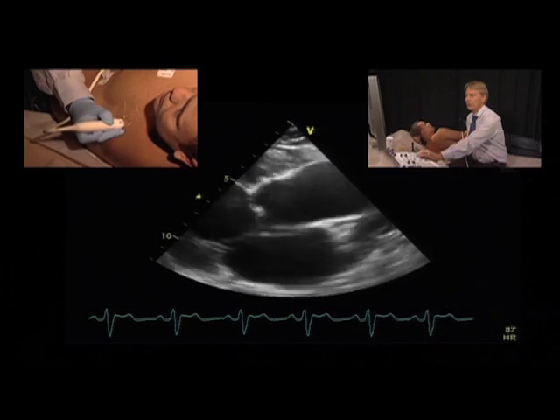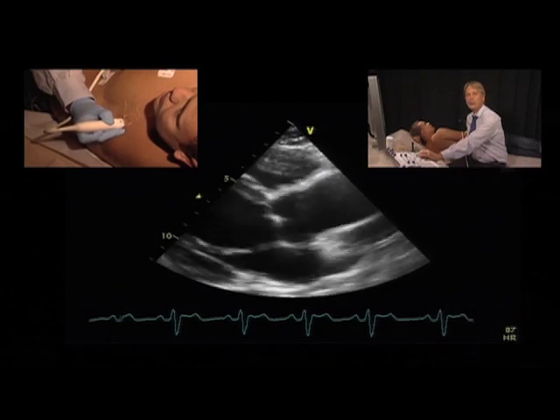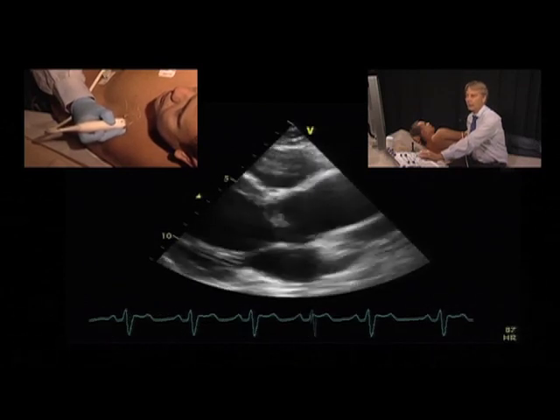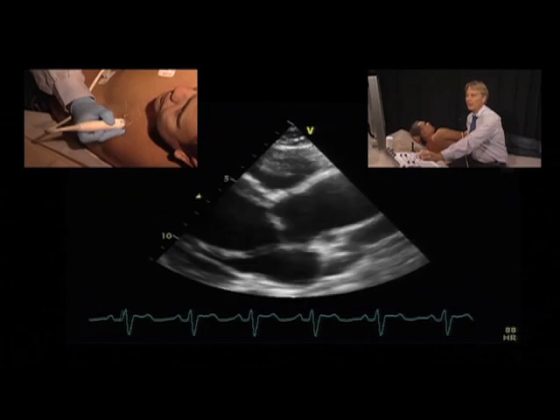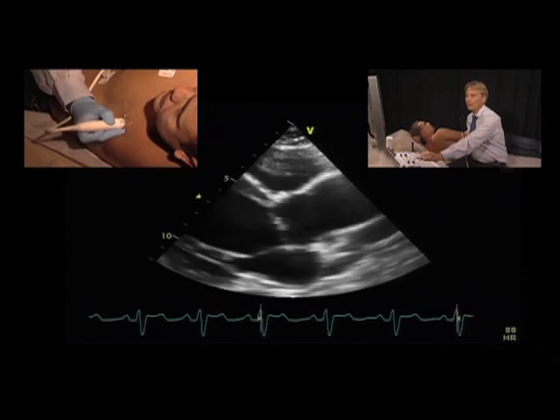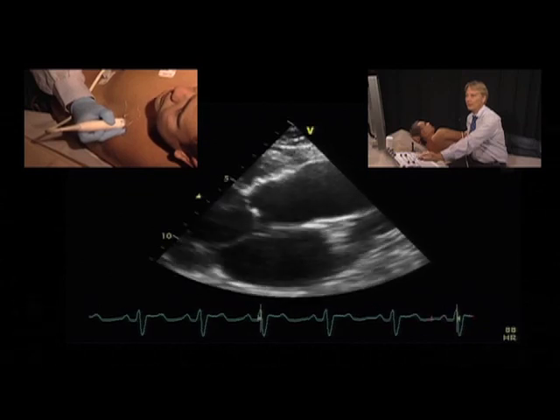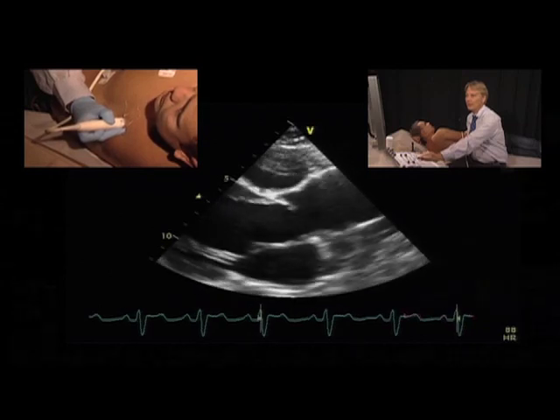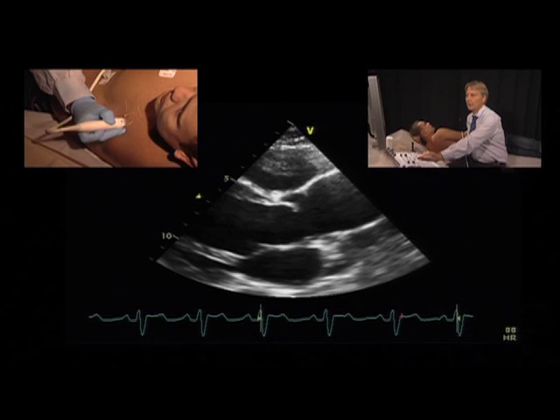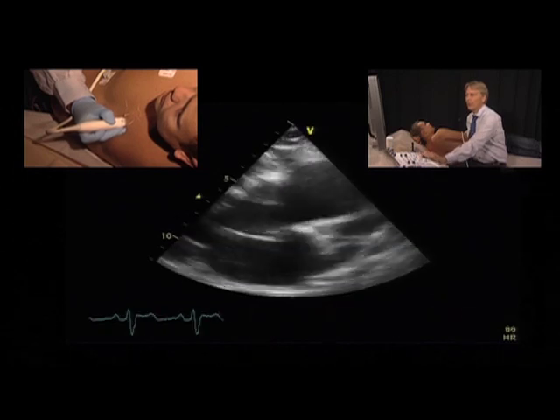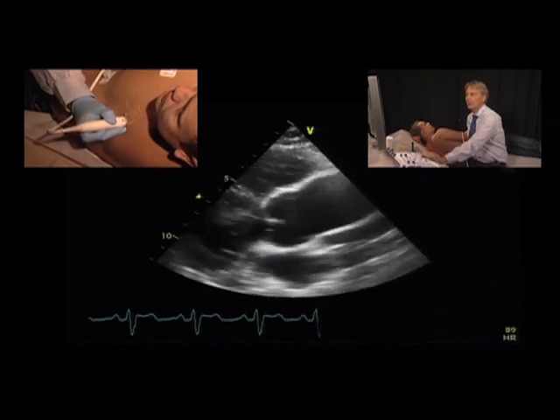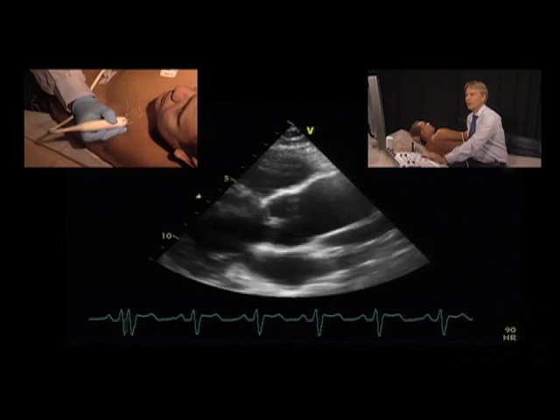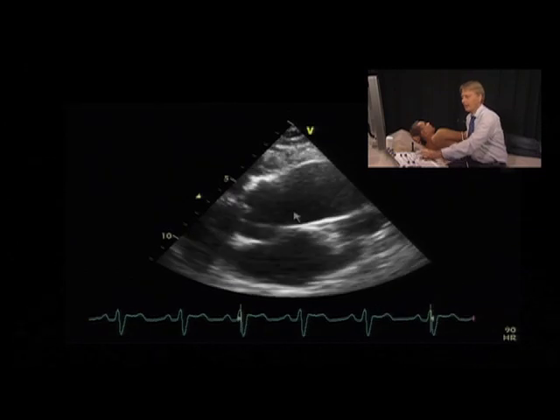We also see that the motion of the aortic valve is abnormal. There is doming of the aortic valve — here in systole there is doming of the valve. In addition, the ascending aorta is also dilated.